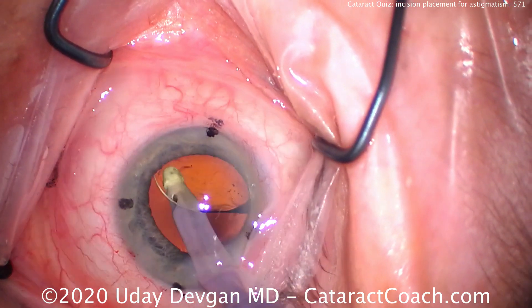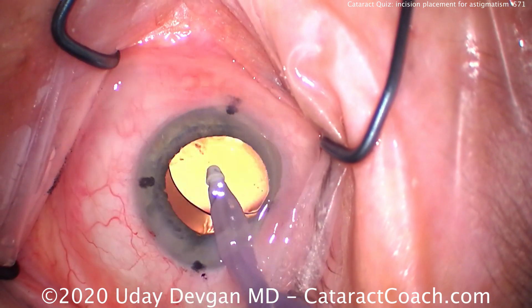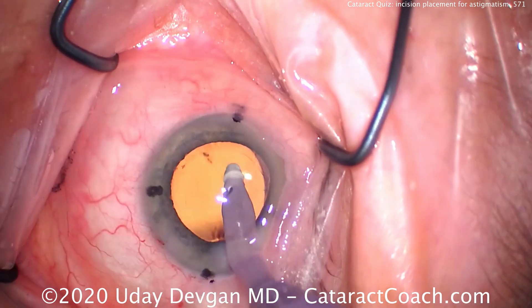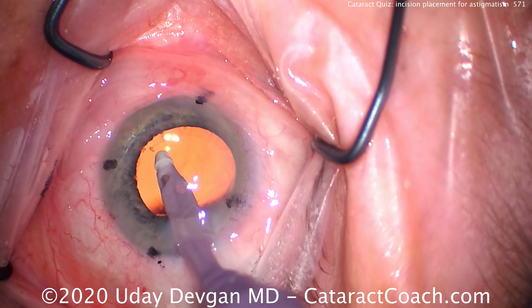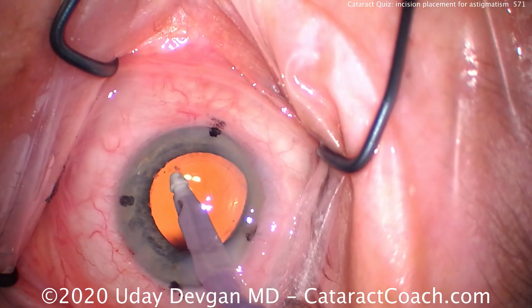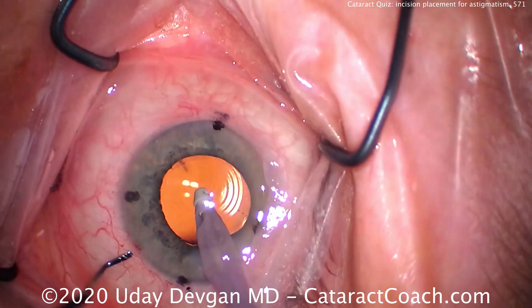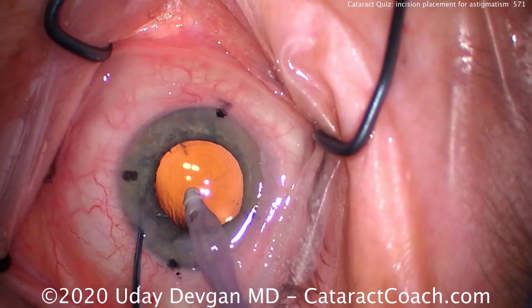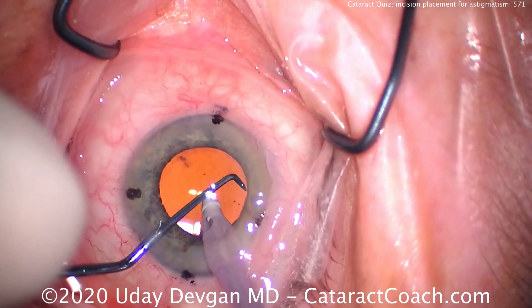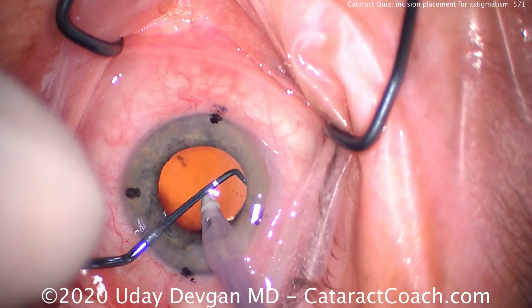At the end of the case, we'll take out our viscoelastic and line up the toric lens. If you make the phaco incision on the flat axis, it will slightly increase the astigmatism, but it will not shift the meridian. That's important — so that's the second best option.